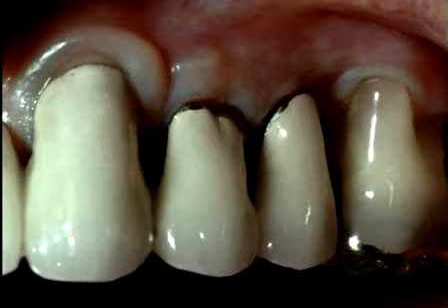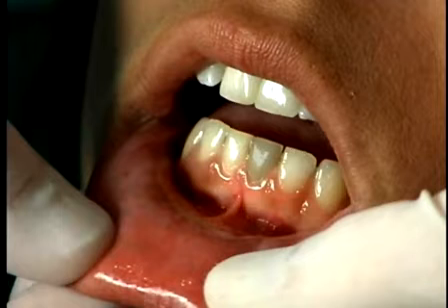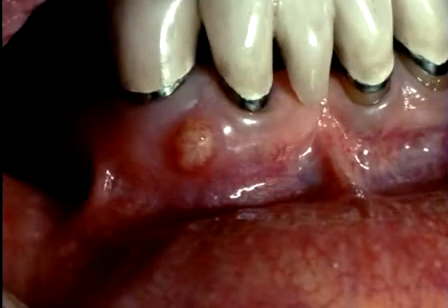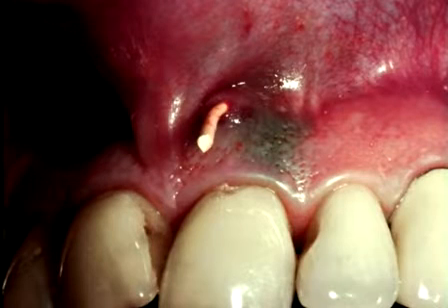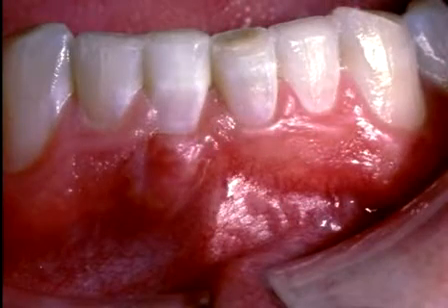to the restorative efforts. We need to look for dark teeth because oftentimes this is an indication of an endodontic problem. We need to look for the presence of a parulis, and when present, they should be traced with a gutta-percha point. Also, oftentimes we'll see a tattoo. A tattoo could be an indication of an old surgical failure or a failing silver point case. Here's a soft tissue anomaly secondary to trauma.